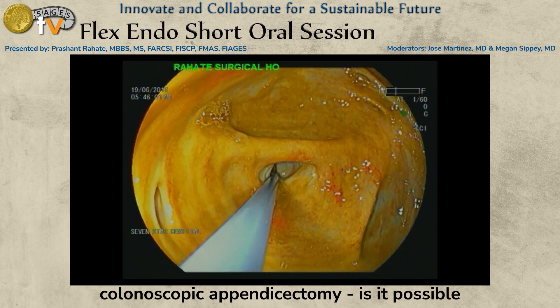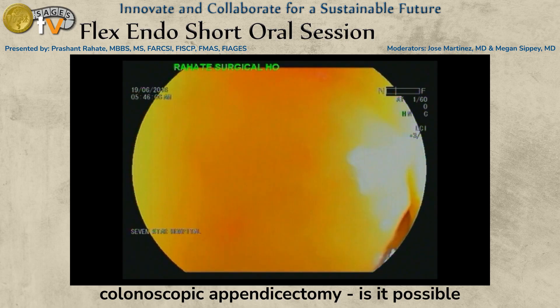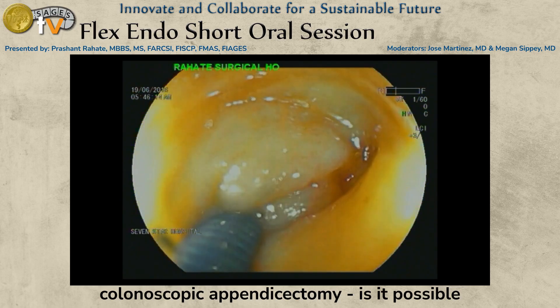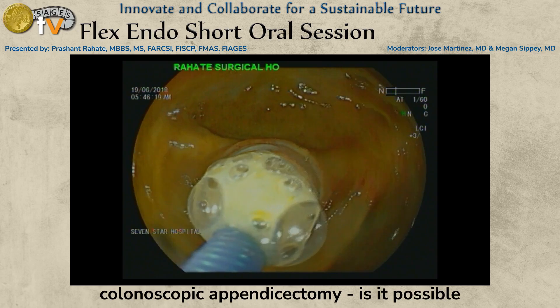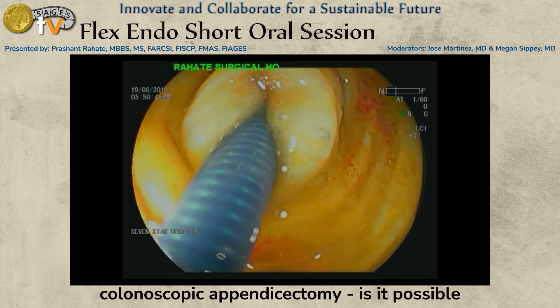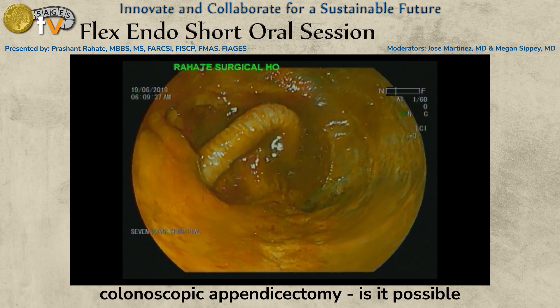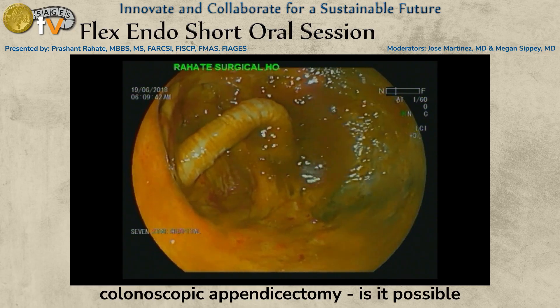Too much pressure is required, and many times the pressure causes the endoscope to be pulled back up to the hepatic flexure. Once it is pulled inside, that pressure is maintained. The pus is coming out. The pressure is maintained while pulling not only the forcep but also the endoscope, so that the appendix is properly inverted. We are now at the level of the hepatic flexure, and the complete appendix is retroverted and inverted.